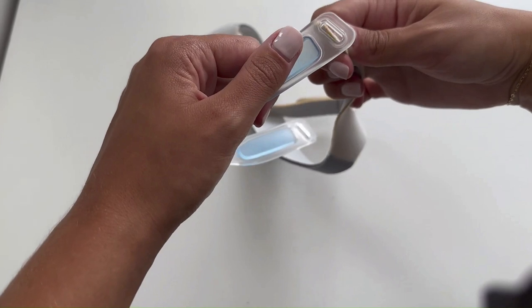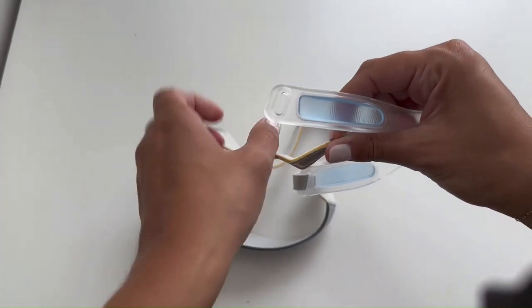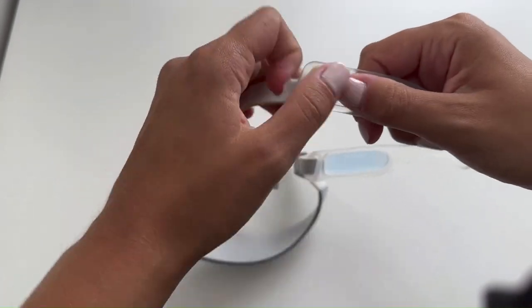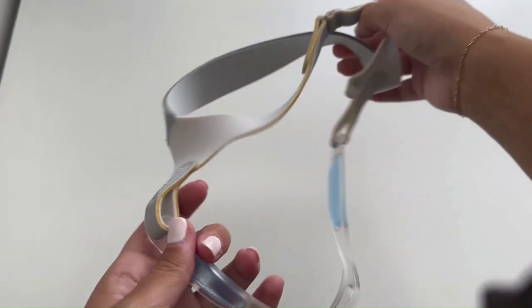To attach the frame and headgear, use the Velcro straps included on the headgear and loop them through the openings in the frame. Attach your cushion and tubing and your CPAP mask will be ready for therapy.